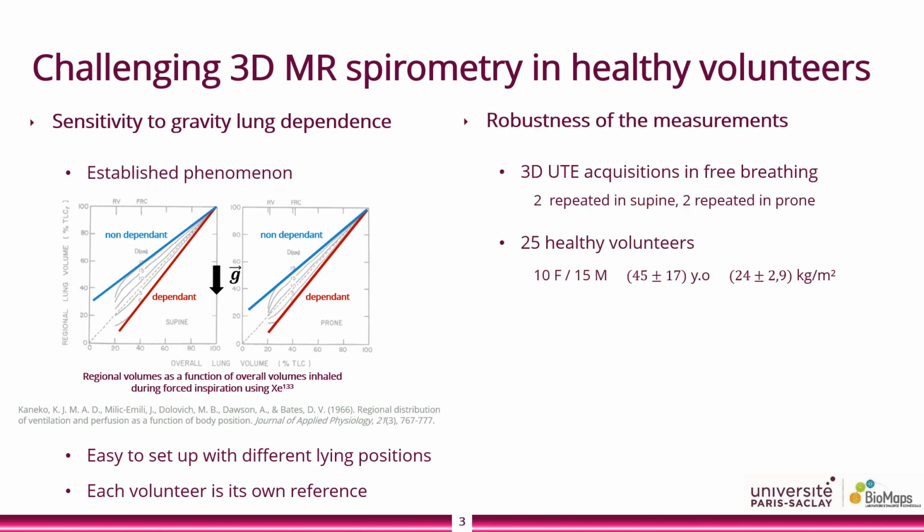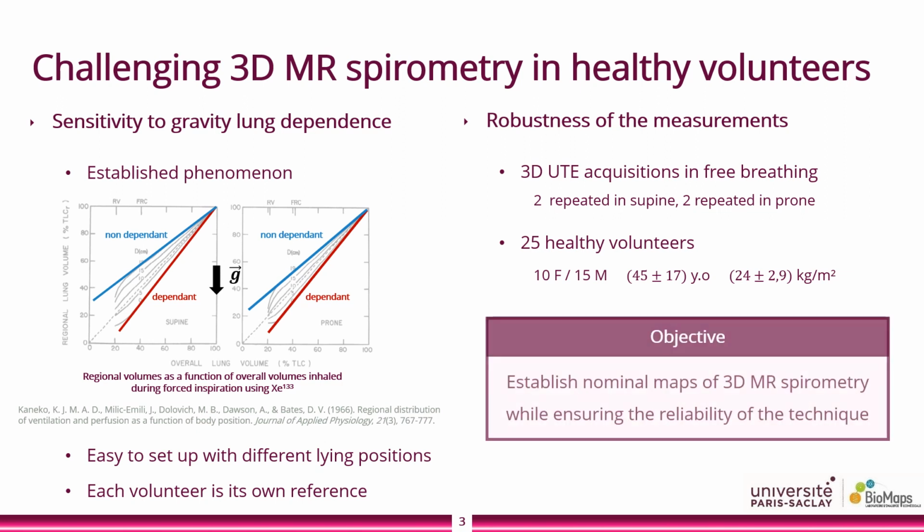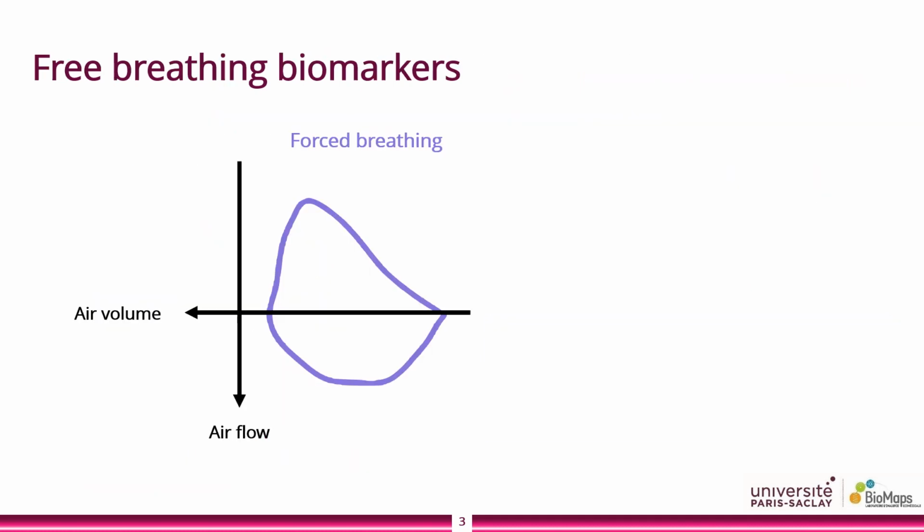Through the design of the study, we can also assess the robustness of the technique by repeating acquisitions for each position and by using a diverse cohort of healthy volunteers. Our objective was to establish nominal maps of 3D spirometry while ensuring the reliability of the technique.